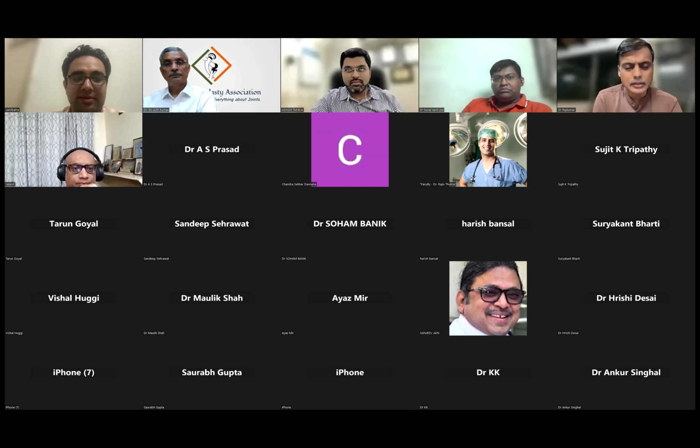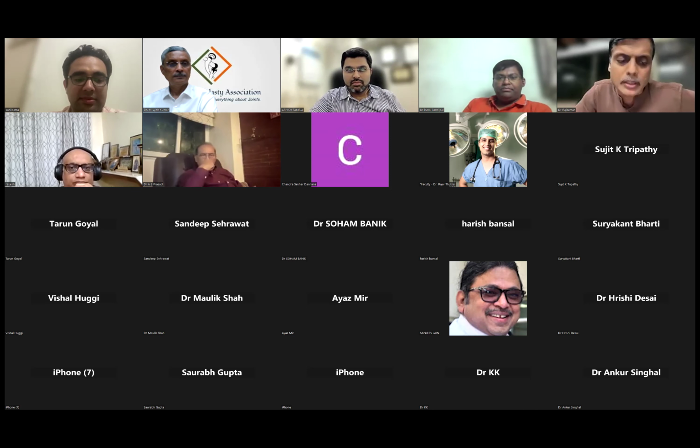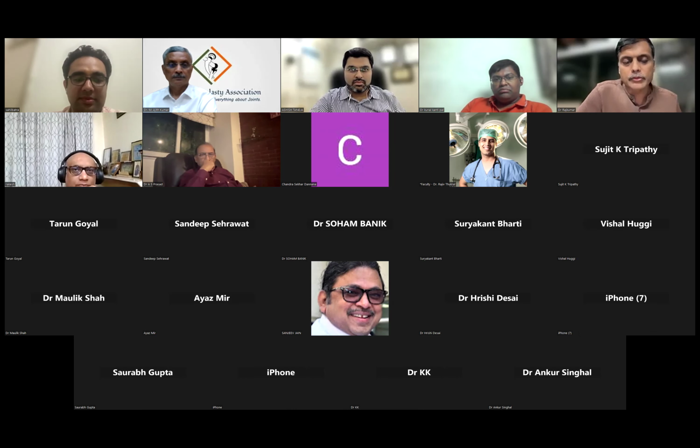Maybe, as Rakesh said, if centers which have a bone bank are all doing this, we should all start reporting that this is being done, like what Sahil has brought out. If these kinds of cases are routinely presented on such platforms, it will be an eye opener, and it will definitely help in restoring the bone stock. The mega prosthesis is not a one-stop solution for everything. I've seen so many cases of mega prostheses and custom-made prostheses coming with loosening at an early stage. So definitely this is a good way to look forward for future revision surgeries.